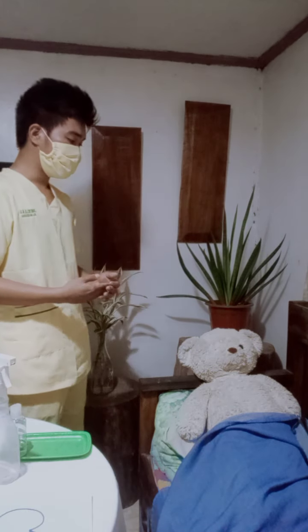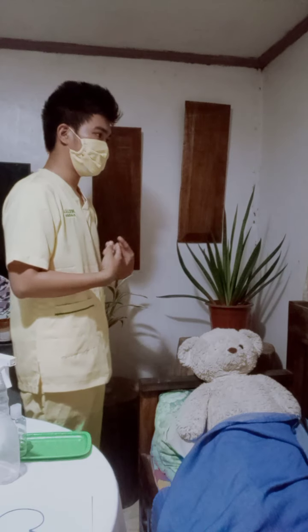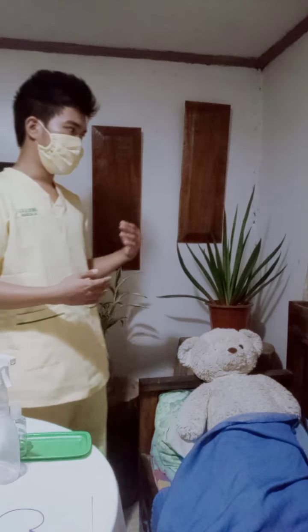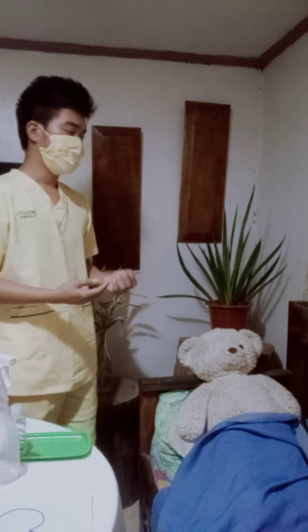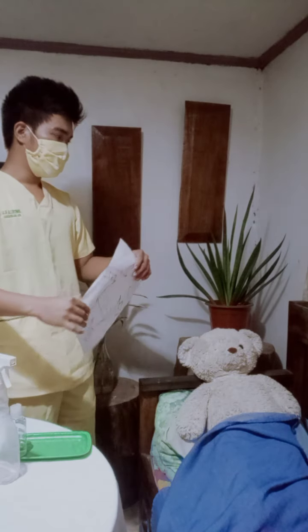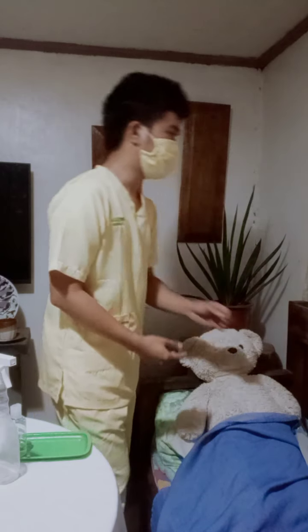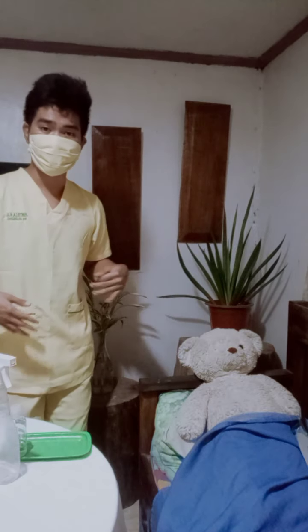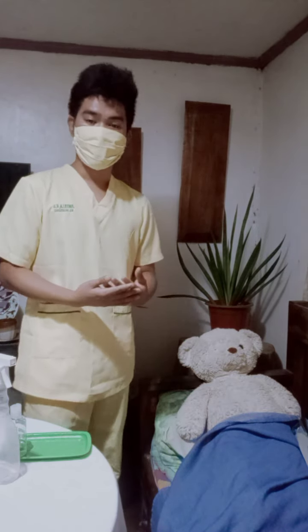Feel free to ask me if you have any questions or clarifications, and provide guidelines to the patient with written literature and visual aids, for example our injection sites. So this is your guideline, ma'am, for your injection sites. Keep it with you, and then document the evaluation of the learning process. We're going to document everything done in the procedure, what we did to our patient.